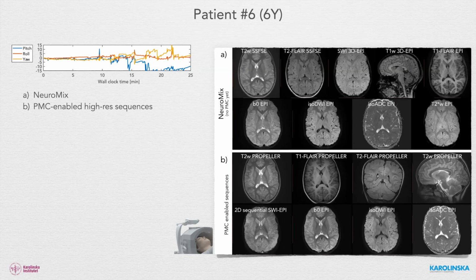And despite that, with the combination of prospective correction, using in this case the tracking system, and having single shot techniques, or at least propeller techniques in this case, we can get very sharp images.